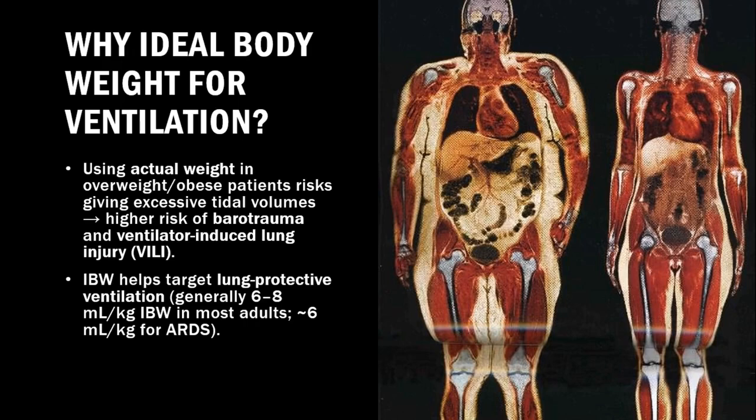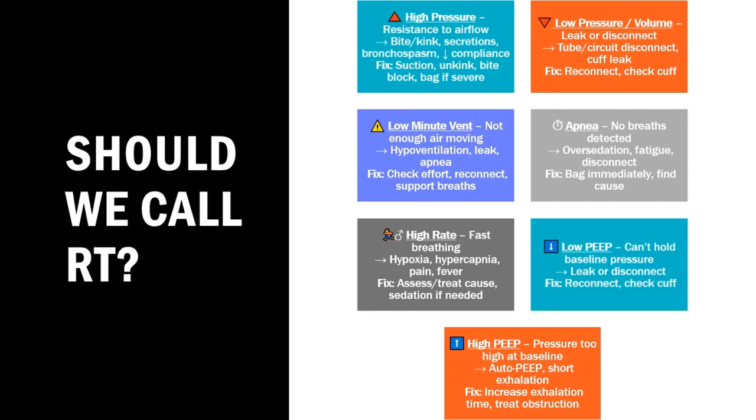So if you ever see a new RT or a paramedic or a flight nurse coming in and they are basing their tidal volume off of actual body weight, you need to stop and question that, because we can kill a patient very quickly if we use the wrong number.